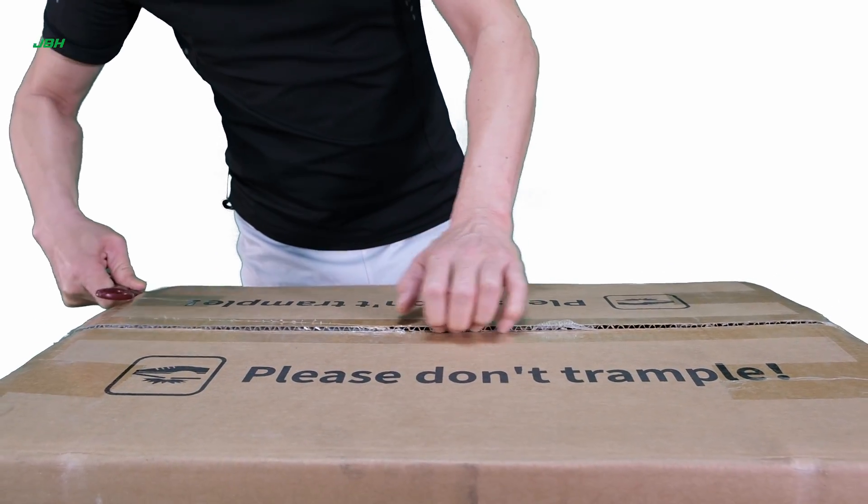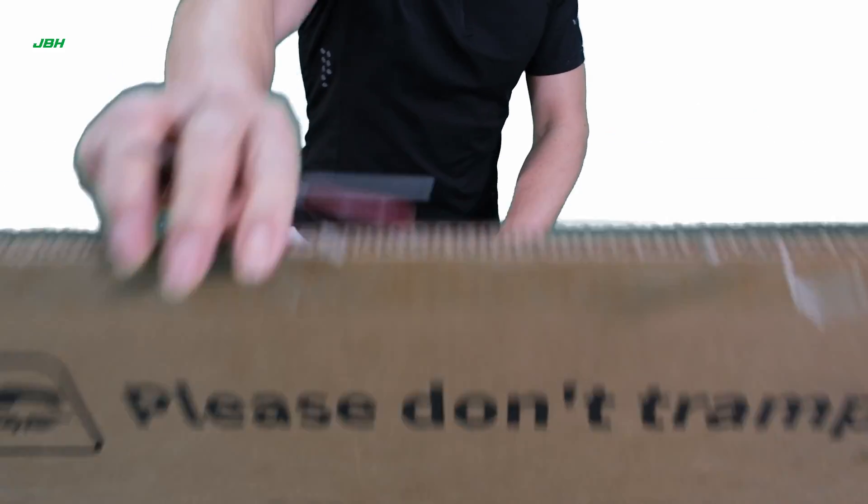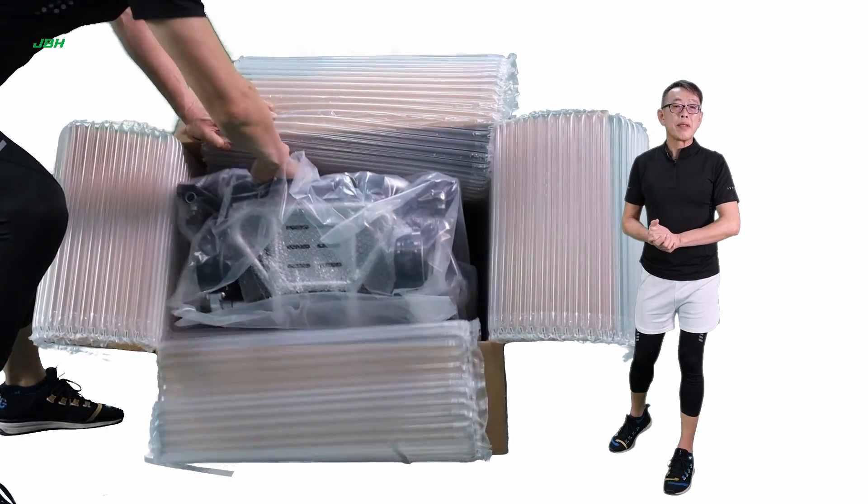Just cut the top of the strap and also the tape off, then we can open up the top of the carton, then lay it down, and drag out the unit. It's really simple and easy.